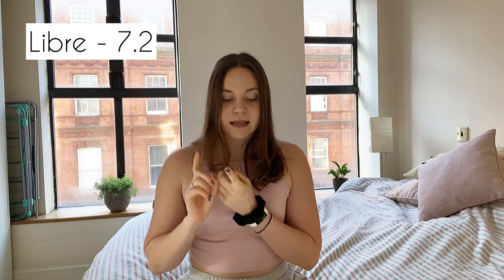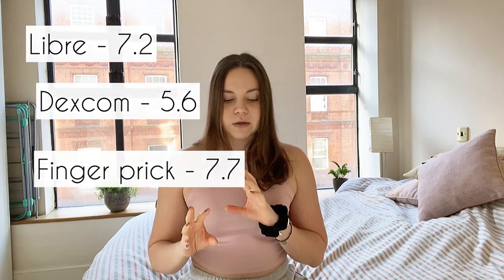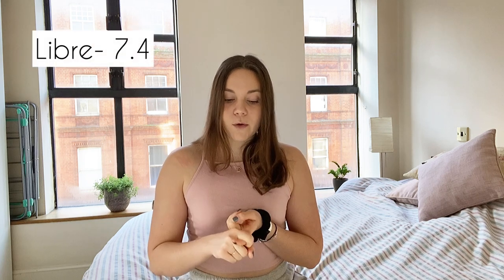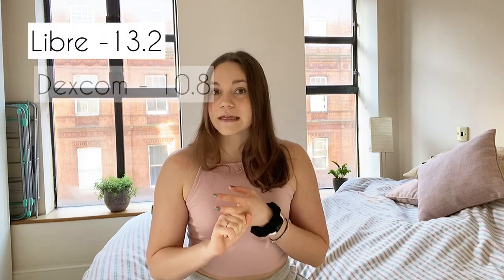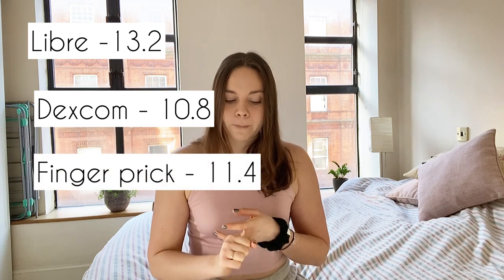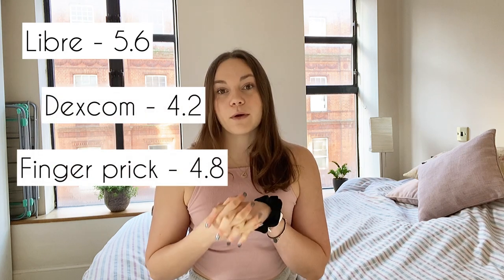Here are the results: at the beginning of the day my Libre read 7.2, Dexcom 5.6, finger prick 7.7 — so the Libre was closer. Partway through the day, Libre 7.4, Dexcom 6.4, finger prick 7.7. I also checked during a rise — that's when sensors tend to lag — and on a high blood sugar my Libre read 13.2, Dexcom 10.8, finger prick 11.4. Finally, Libre 5.6, Dexcom 4.2, finger prick 4.8.